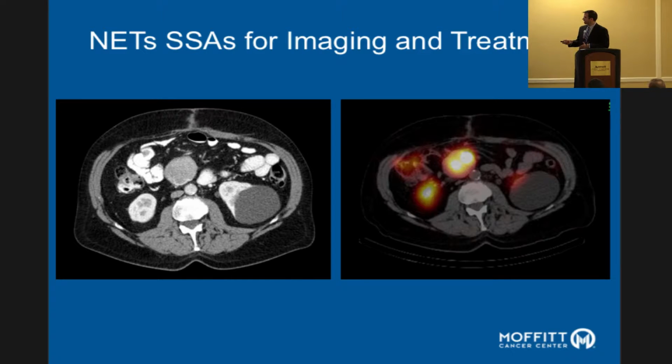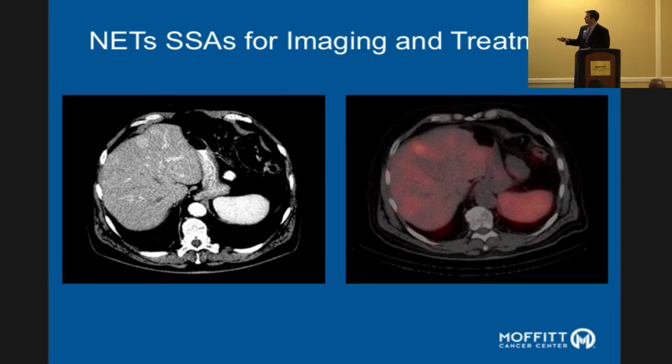This is another case. Now you can see maybe the diagnostic utility of an octreoscan, so why it might help you. Even with very, very advanced CT and MRIs, this is a metastasis in the liver. So the tumor has gone to the liver. But you can see if this were just a little bit smaller, it'd be very hard to pick out from just normal vessels. And also, if the timing of this exam were a little bit different, if it were a few seconds either way, earlier or later than when this was acquired, you might not see this at all.